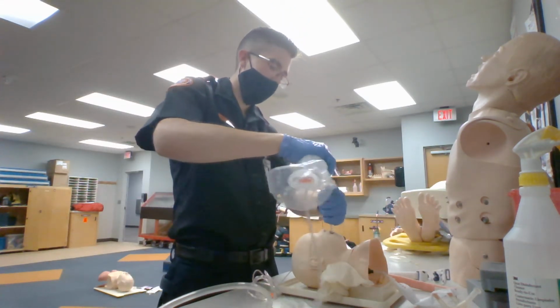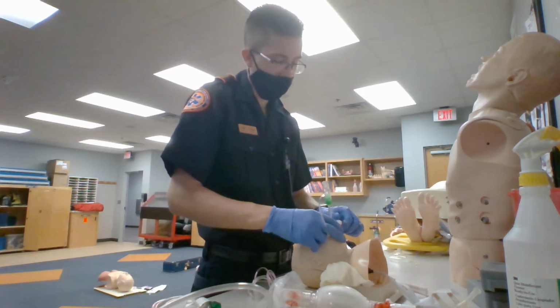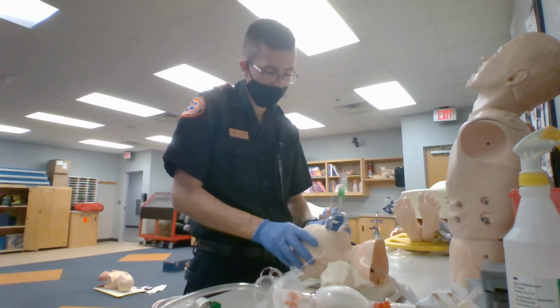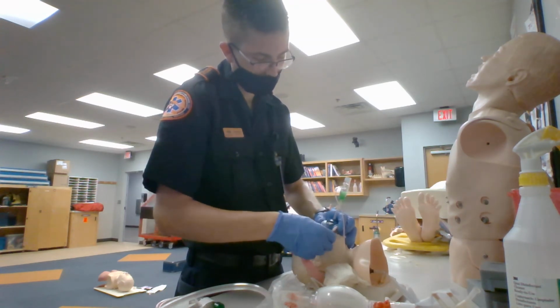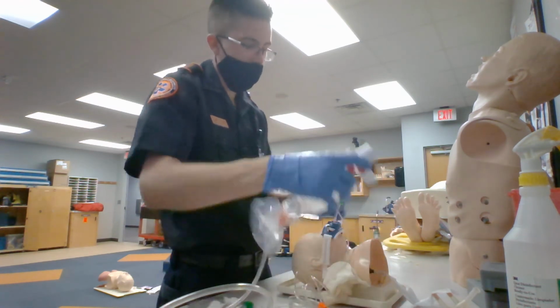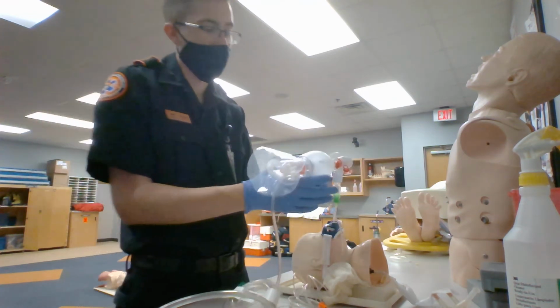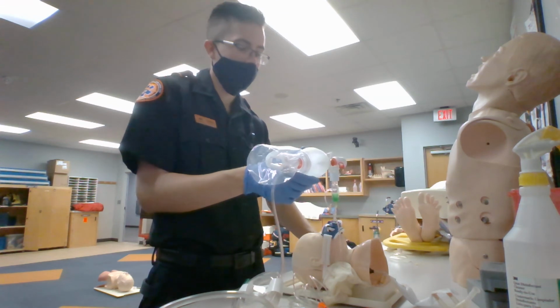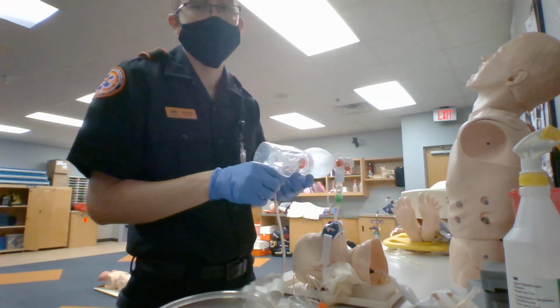Once I've done my secondary confirmation, I'm going to stabilize my tubing, continuing to monitor for hypoxia, watch over their SpO2 monitor as well as capnography, continue to ventilate 10 to 12 times a minute, monitoring for adequate chest rise and fall, and then monitor for any change in patient condition and route to the hospital.